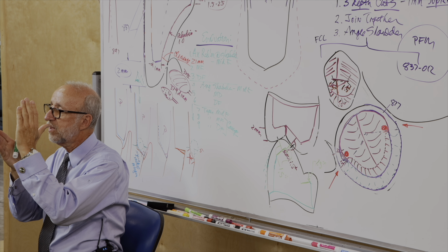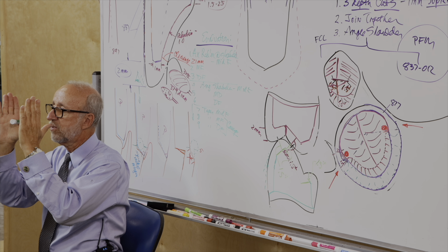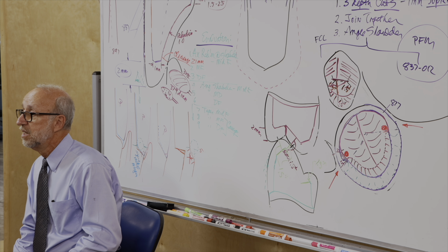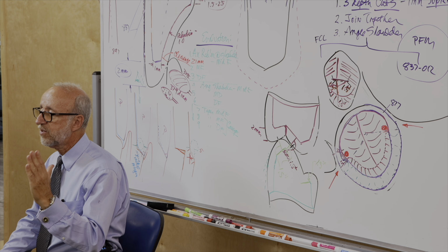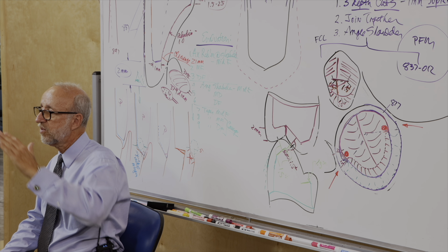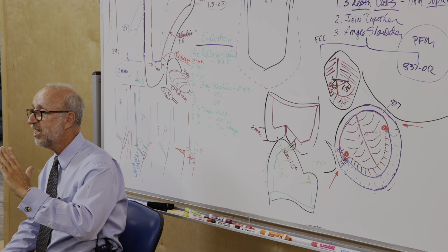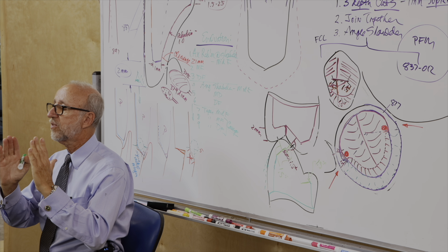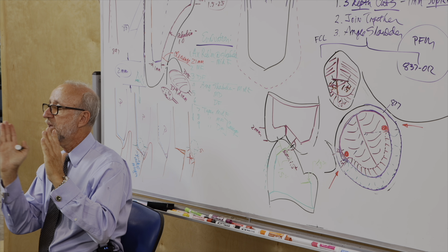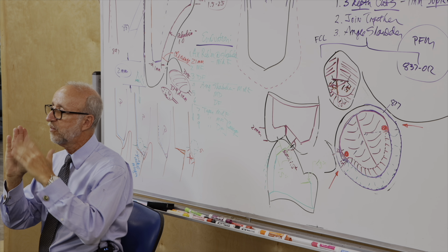So oftentimes, if we get the tapers right in both those areas, secondary plane on both the facial and the lingual would be appropriate on the upper. On the lower, of course, we have secondary plane typically on the facial because of the rounded surface coming inward, as long as you don't over taper. On the lingual, the surface tends to lean lingually, doesn't it? Okay? So if we get a little taper on the lingual, we don't need a secondary plane.